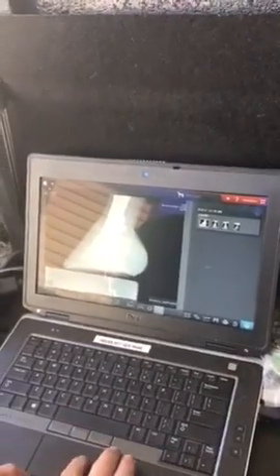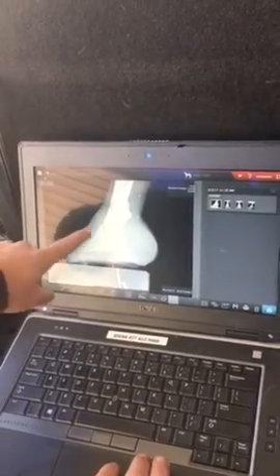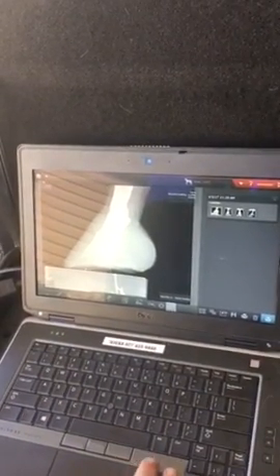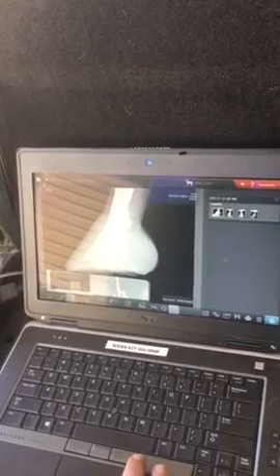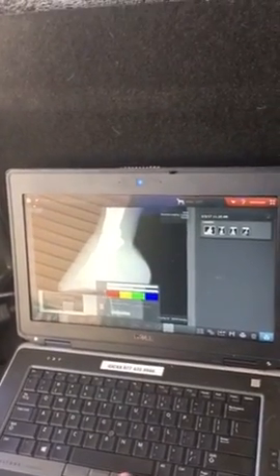So what you're going to see is the orientation of our dorsal hoof wall and P3, which is our coffin bone, looks pretty good. As far as sole depth, it's pretty good, 12 millimeters, which is about normal.